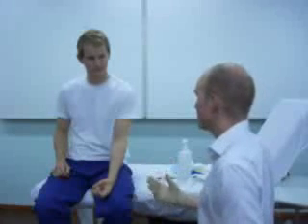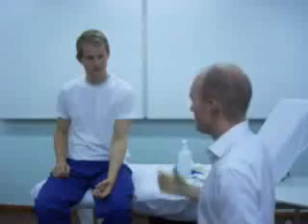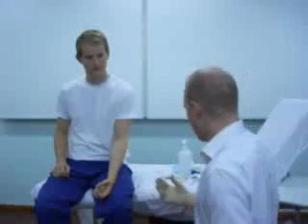Takes a couple of minutes to do the procedure. Can be a bit painful sometimes, causes a little bit of bleeding as well. The risk of infection when the cannula is in is also a possibility. So you explain all those things.